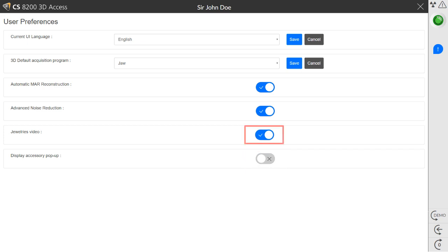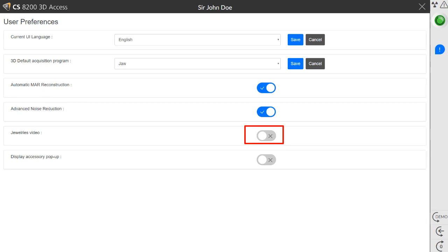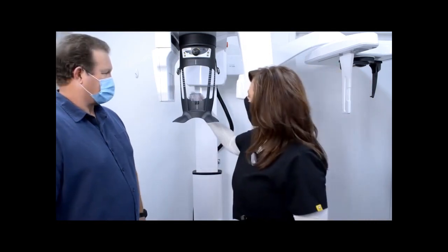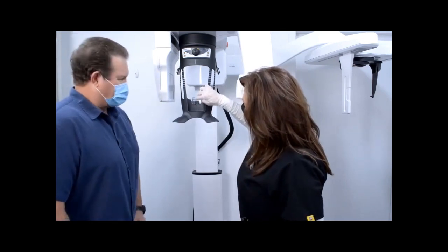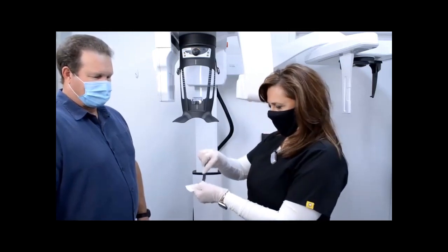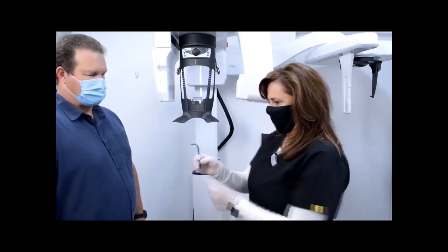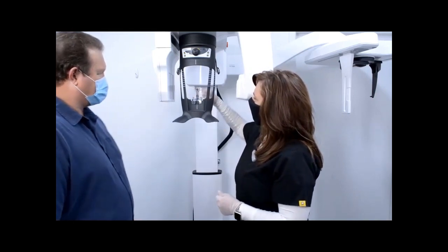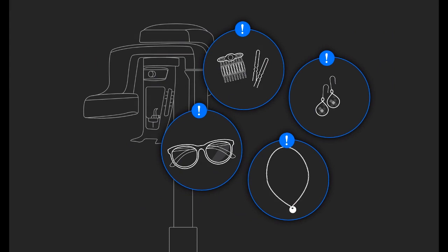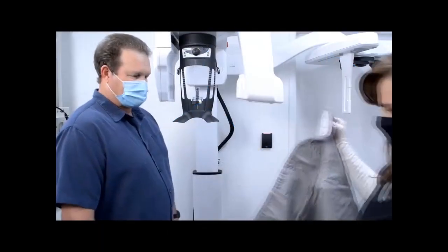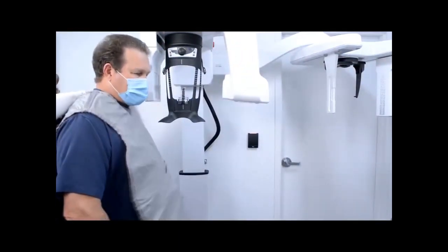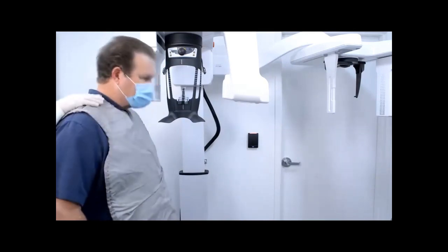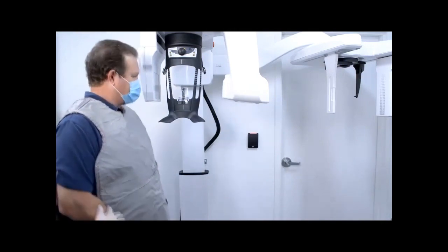You can also toggle the switch here to disable the jewelry video. Position the panoramic chin rest and make sure it clicks firmly into place. Cover the bite block with a plastic hygienic barrier and ensure it is completely covered. Fit the bite block to the panoramic chin rest. Before the patient enters the unit, ask the patient to remove any metal objects above the neck, including jewelry, glasses, hearing aids, prosthesis, metal hair clips, or other metal objects. Place the lead apron on the patient and instruct the patient to stand next to the unit.